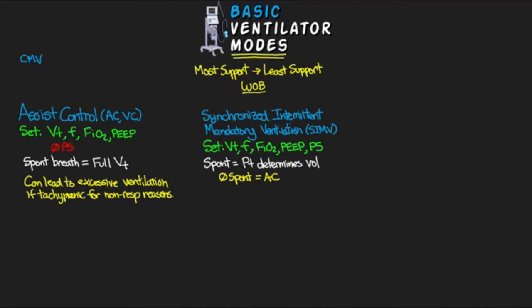Well, if they were in AC, again, they're going to still be getting every 5 seconds a volume of 500. And again, they're not taking any spontaneous breaths, so that's all that they're going to get as well. And these two modes are going to be completely indistinguishable from one another.